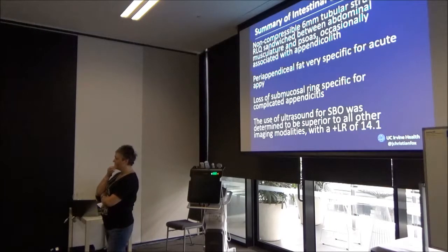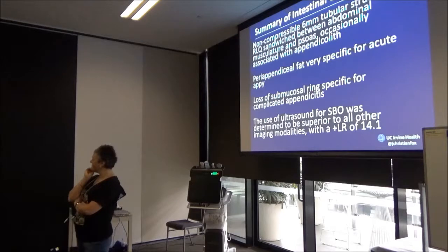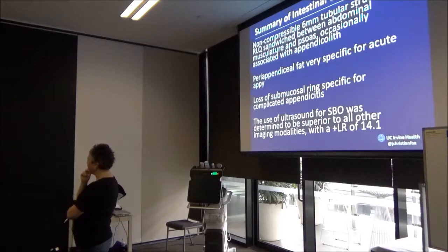So you have this problem? Yeah, of course, yeah. You have the same problem everywhere, but that's okay. Pediatric surgeons hate CT scans. Adult surgeons love CT scans. We generally tend to observe in our patient population.